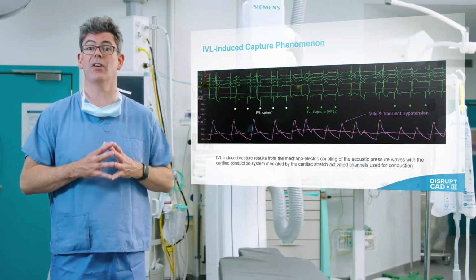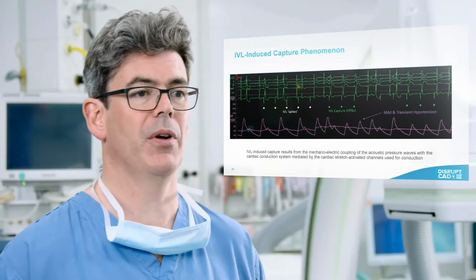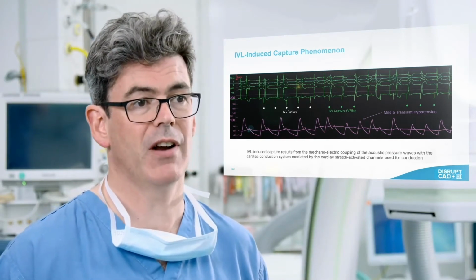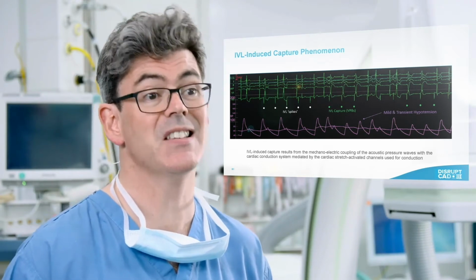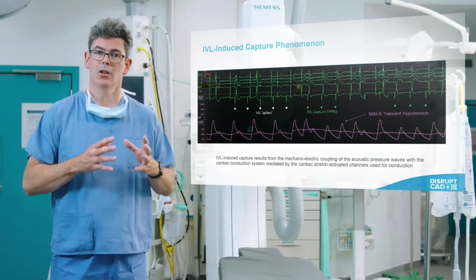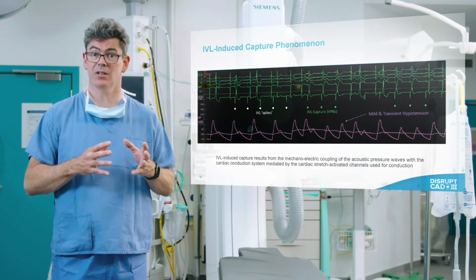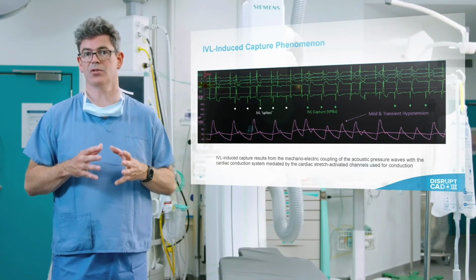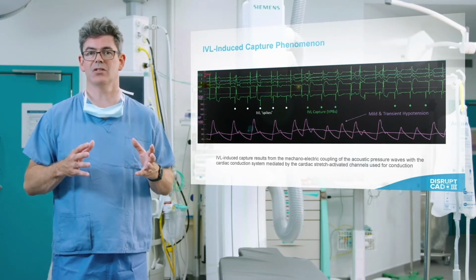IVL ventricular capture has been noted before this study, and in this study demonstrates that 41% of patients had some evidence of IVL-induced capture. It was significantly more common if the pre-procedure heart rate was lower, particularly by multivariate analysis less than 60 beats per minute. The drop in systolic blood pressure was more frequent, but as you can see, not more severe based on this analysis, and there were no significant sequelae.